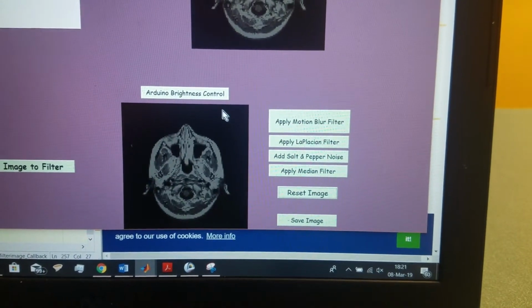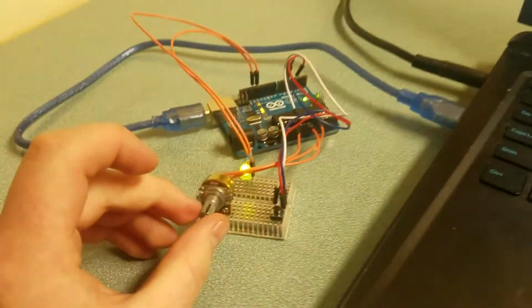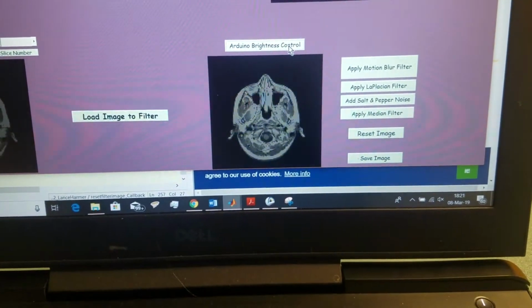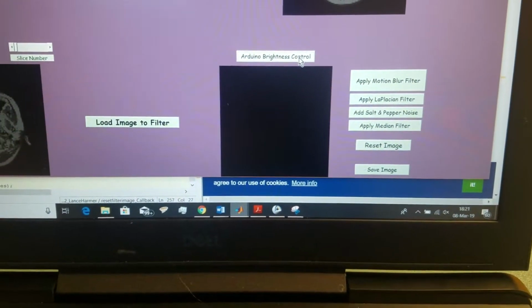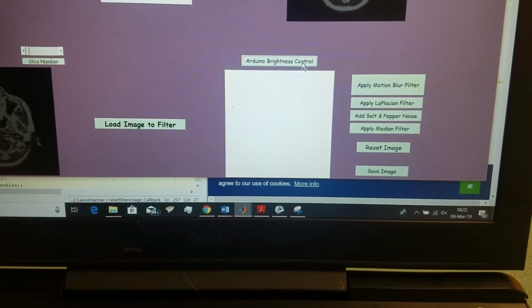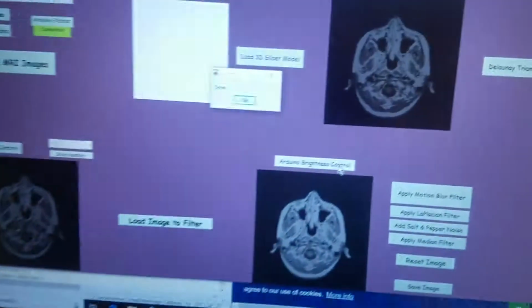But another thing that we can do is the Arduino brightness control. So when that's pressed, you can come over here, the LED lights up, showing that we're in control, basically. And then as we turn the knob, we can range all the way from black to fully white. Obviously, somewhere in the middle here is optimal. To terminate, you just press the button and receive the message done.